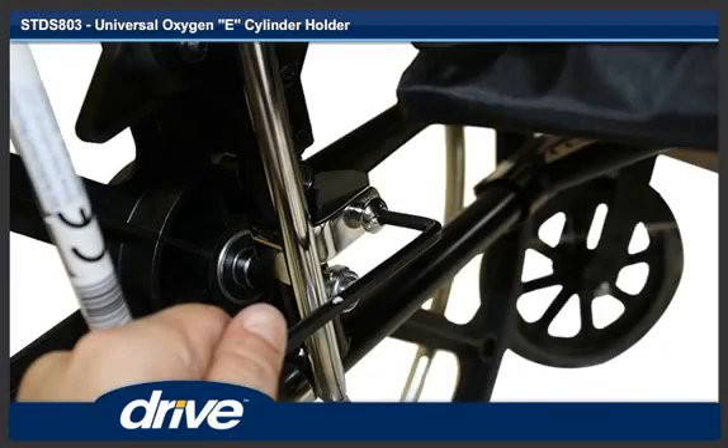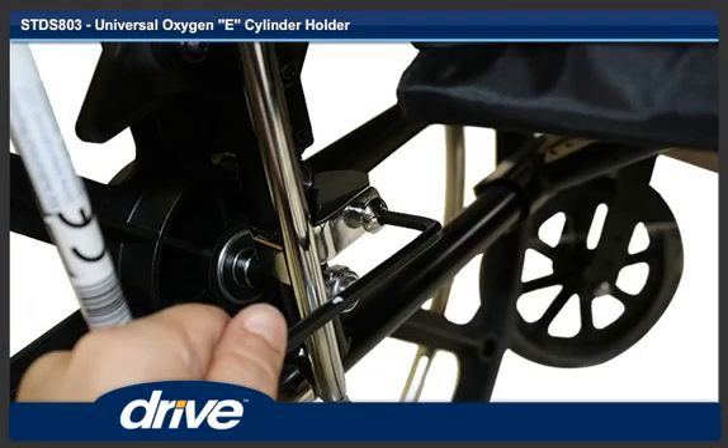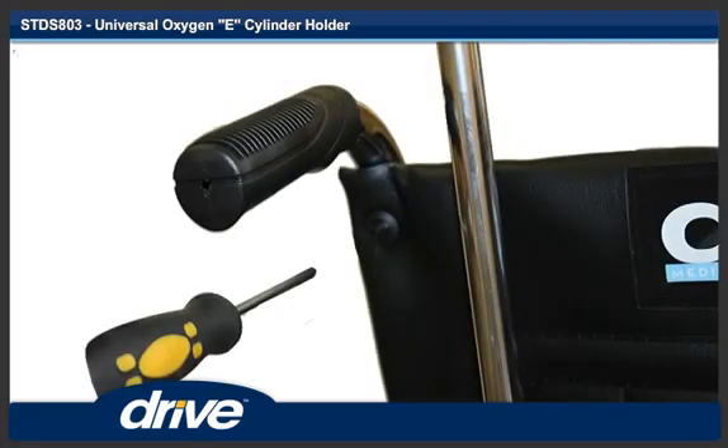Step 5. Tighten with the metric Allen wrench. Step 6. Remove the upper left backrest screw.